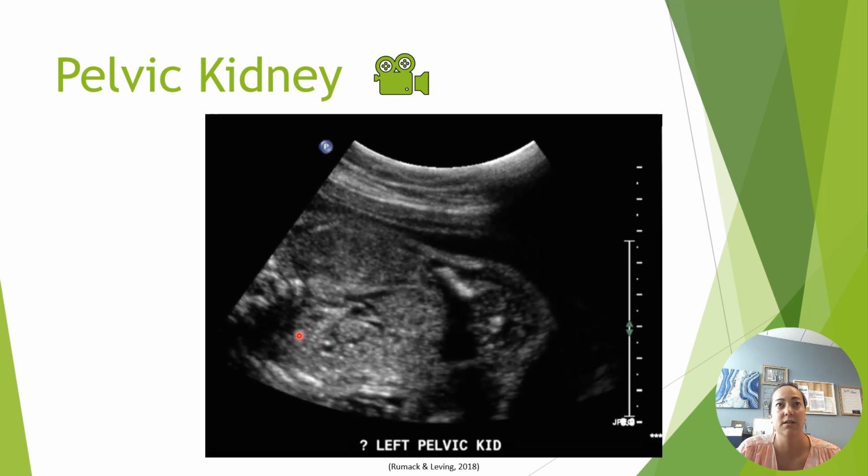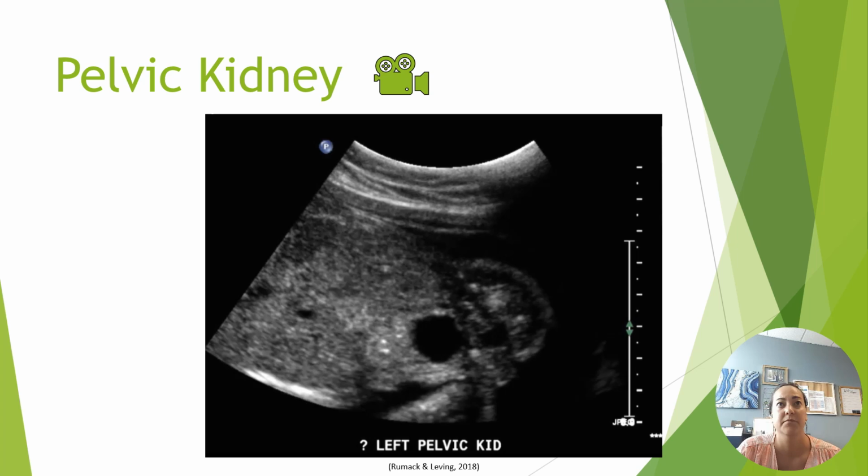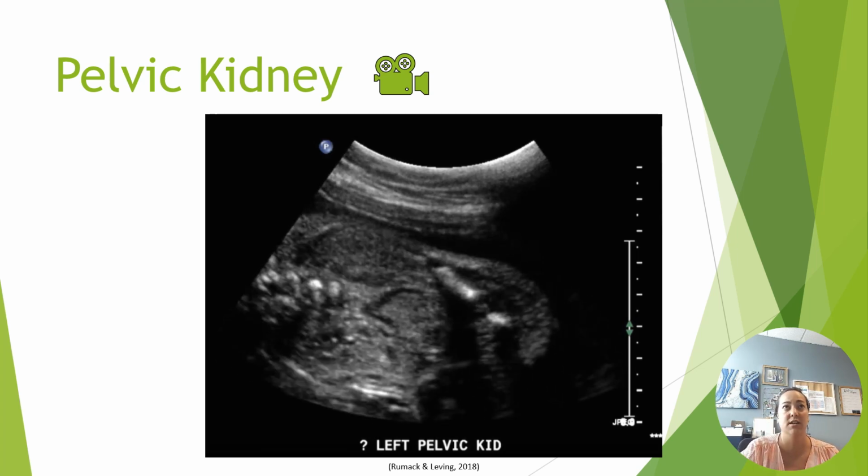Absent kidney here, and then kind of a bit lower. So checking all of the areas that kidney would be located.